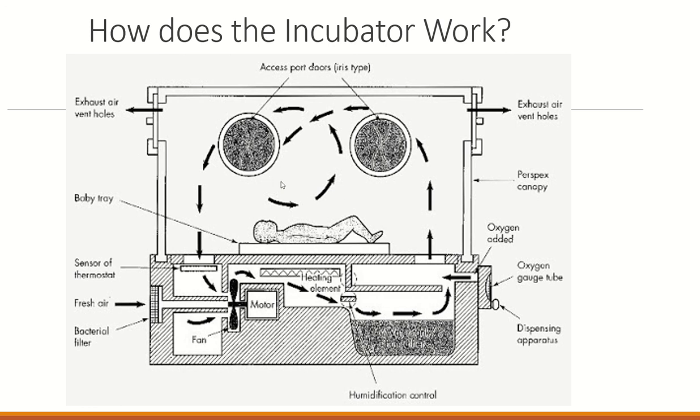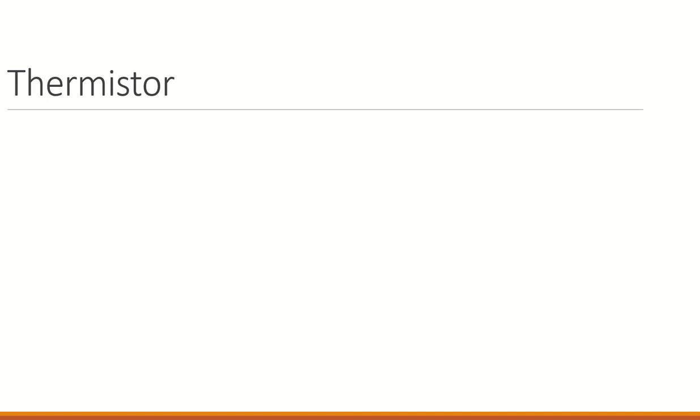But as I said earlier, hot air rises. It's less dense. But as it rises, it loses energy. And it becomes a bit heavier and cooler, and so it starts to sink. Now you have an understanding of how the baby incubator works. Now let us continue. I was mentioning the word thermistor earlier.